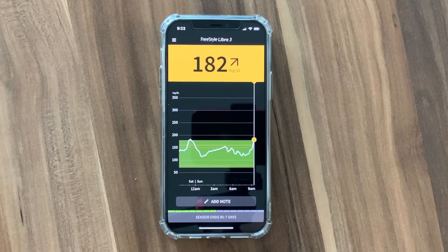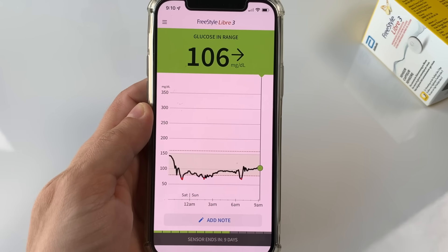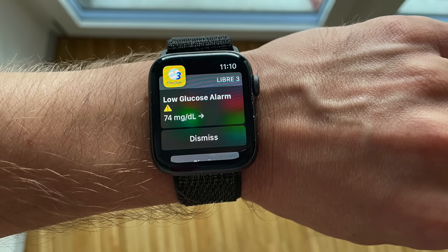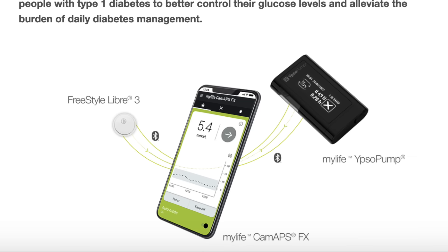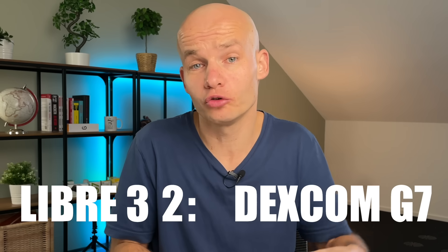Libre 3 can be paired only with its phone app at this point. Unlike Dexcom, Libre 3 doesn't let you view your data on your watch — there is no watch app available whatsoever. Libre 3 should also be able to integrate with insulin pumps in the future as it has the iCGM status, but the timeline is not clear. One bright exception is the MyLife Ypsomed pump — Libre 3 now integrates with this pump in Germany as its first insulin pump integration and first commercial closed loop. Overall, when it comes to integration, I give a point to Dexcom because they have clearly achieved a lot more in this area to date.